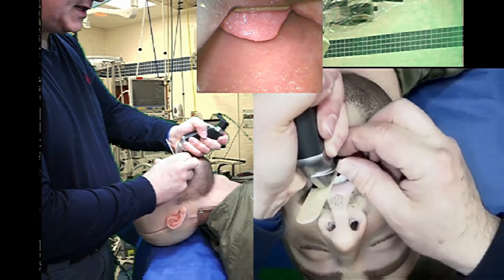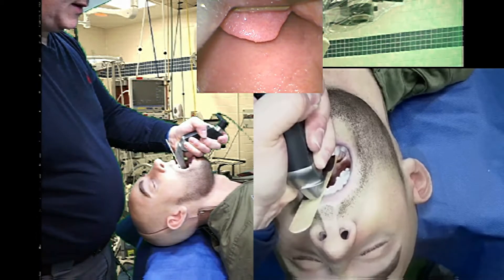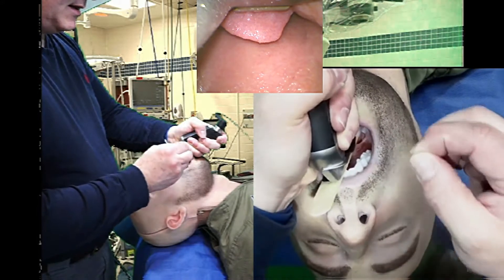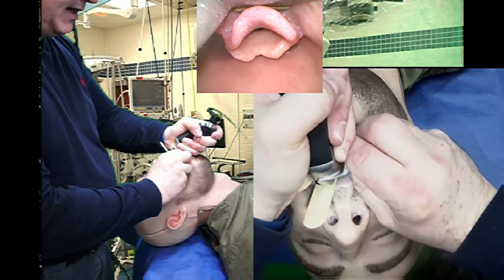The salad pinch is where I grasp the blade with my free hand, in lieu of simply putting this hand behind my back, which is basically what we're always doing. Many of us are doing external laryngeal manipulation, but I think that the micro skill of actually using the right hand to do small tiny movements with the blade makes more sense.